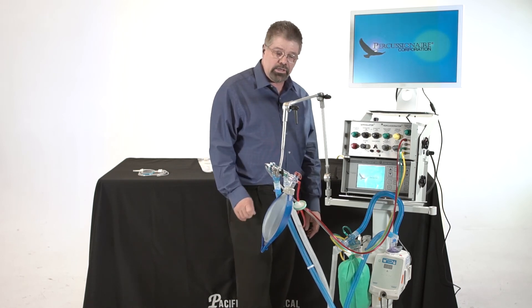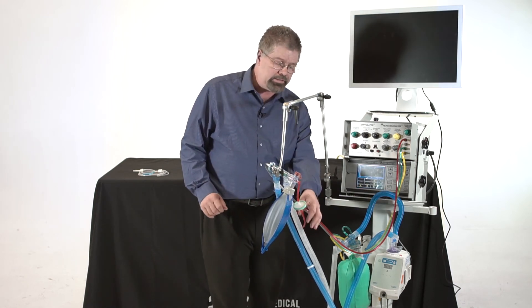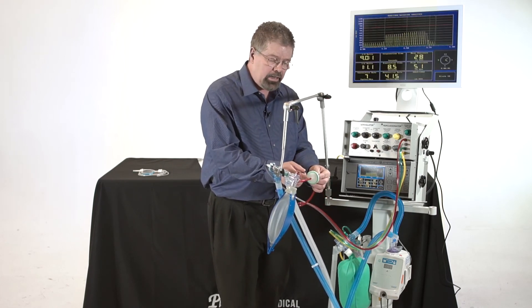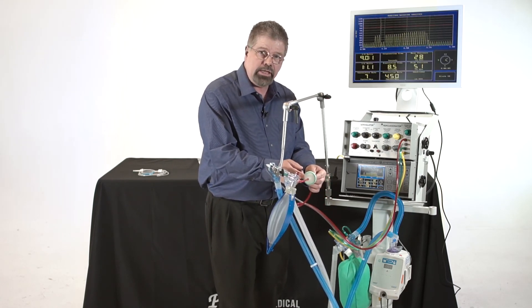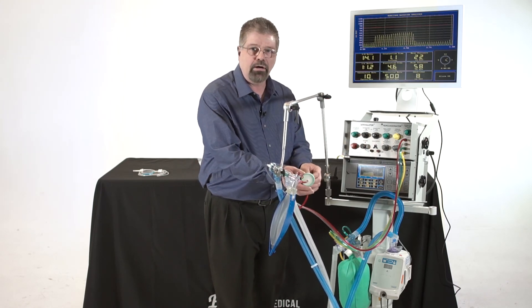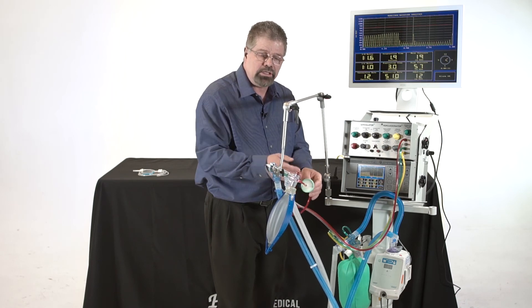One thing I want you to notice again and let's talk about is that there is a filter in this red line. This is a hydrophobic filter. It is meant to protect the ventilator from excessive water. If it gets more than half full of water, please change it.